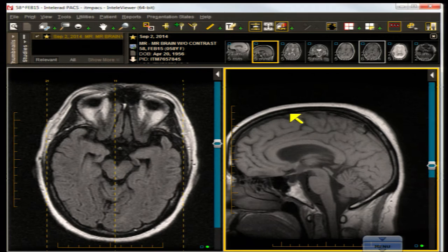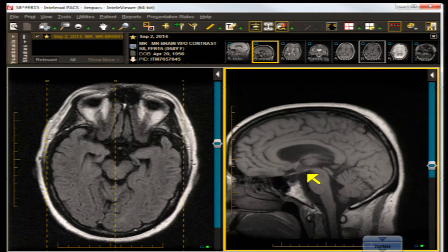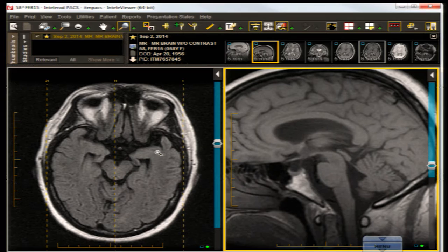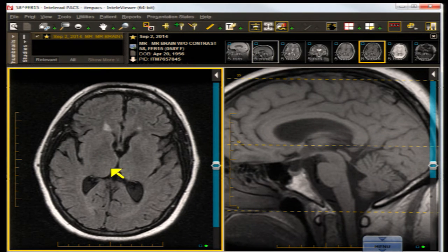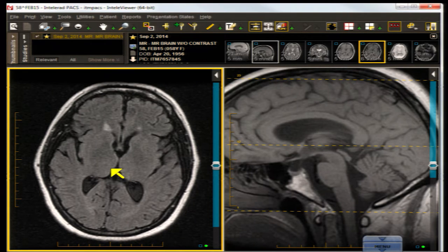Wernicke's encephalopathy usually has a history of alcohol use. Patients may have seizures, and the mammillary body may be hemorrhagic or severely atrophic. This mammillary body is small — but it is not hemorrhagic. Wernicke's may be associated with bilateral basal ganglia and bilateral thalamic hyperintensities, not present here. The history also doesn't support it; Wernicke's is a more acute phenomenon. So the most likely diagnosis is semantic dementia.